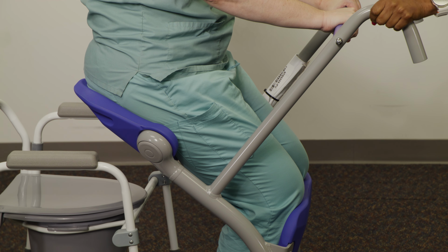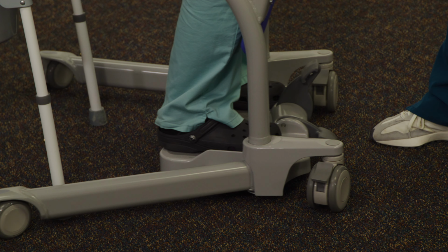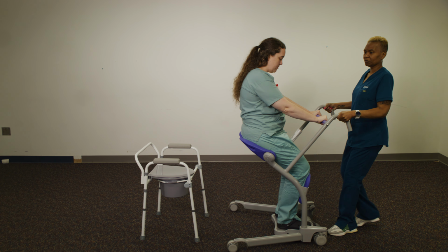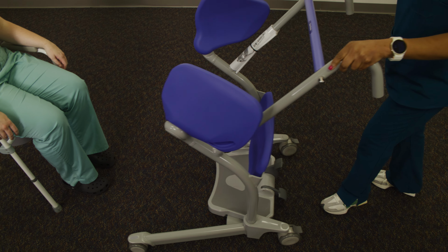and have the patient sit. Unlocking the wheels, the patient can now be mobilized to the chair, commode, or other seated surface. Have caution, the weight limit for this device is 400 pounds.